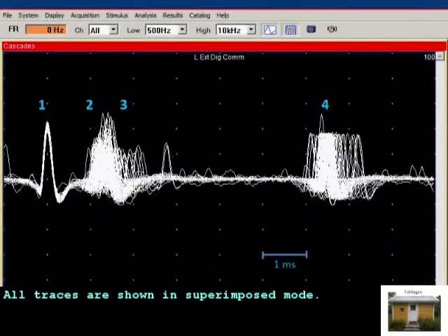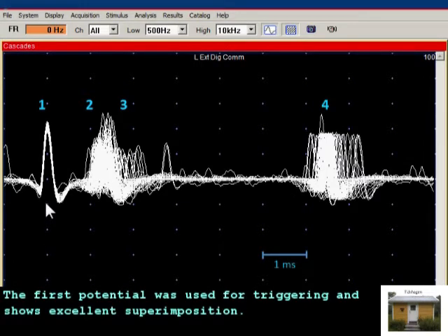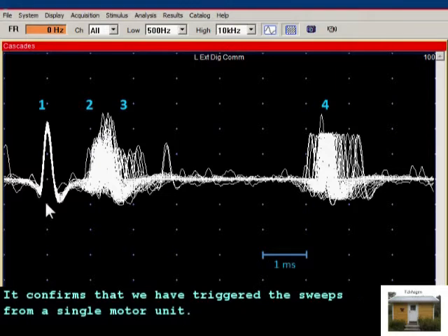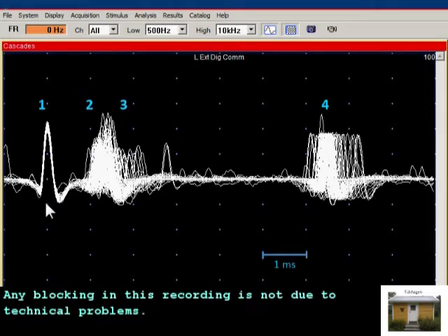All traces are shown in superimposed mode. The first potential was used for triggering and shows excellent superimposition. It confirms that we have triggered the sweeps from a single motor unit. Any blocking in this recording is not due to technical problems.